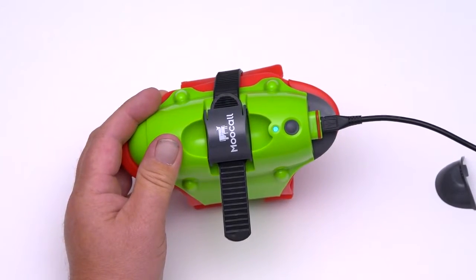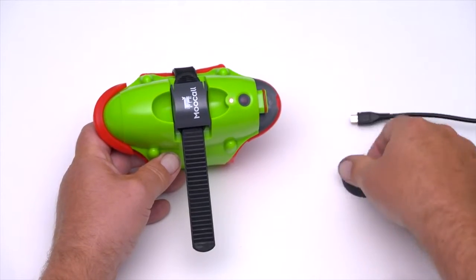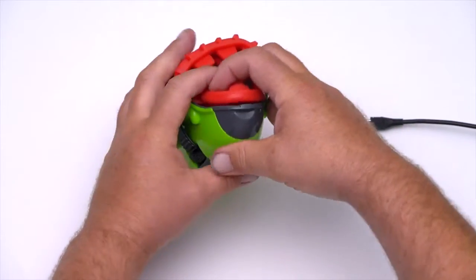A solid blue light indicates that charging is in progress. A solid green light indicates the sensor is fully charged. Place the waterproof charge cap back on the sensor and refit the red rubber lining.